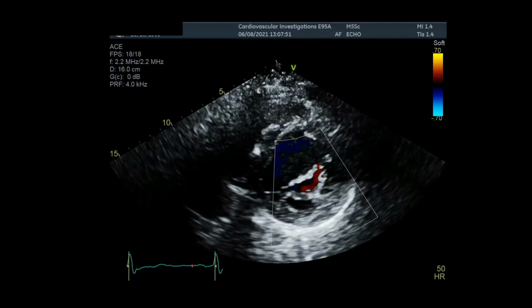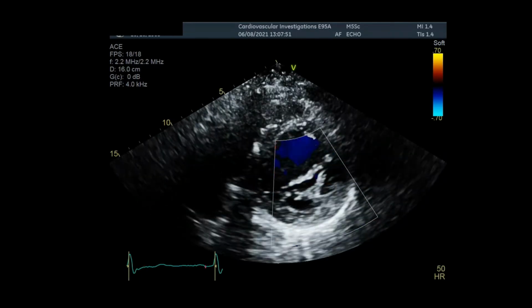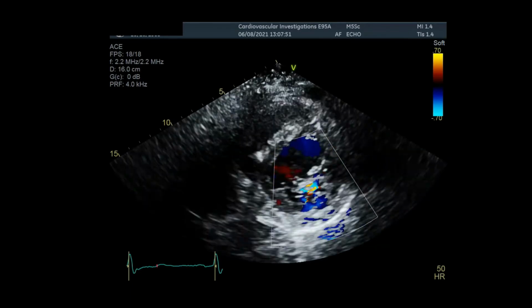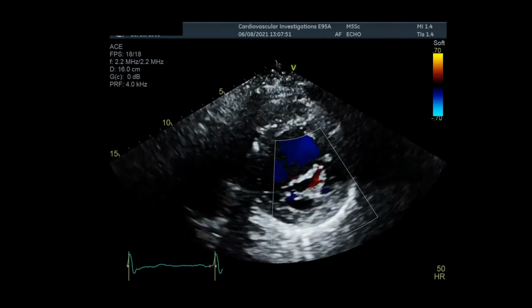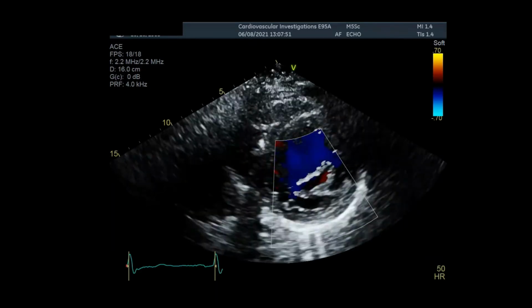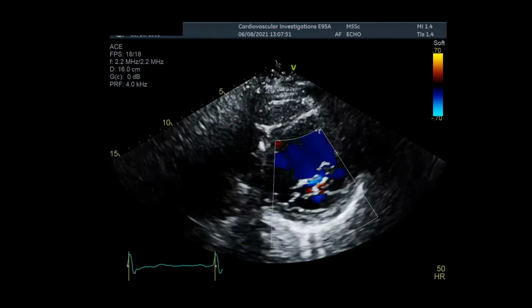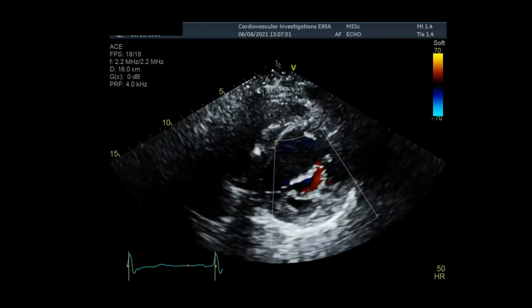And this is an example of MR. So what you can see is in ventricular systole, there's a high velocity jet of blood coming back towards us out of the screen, which is the kind of light blue yellow jet.